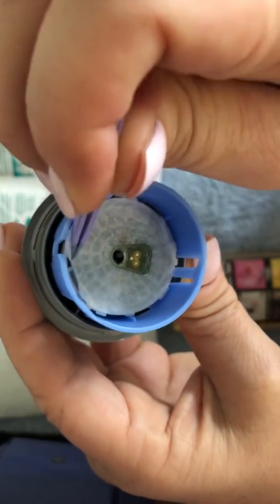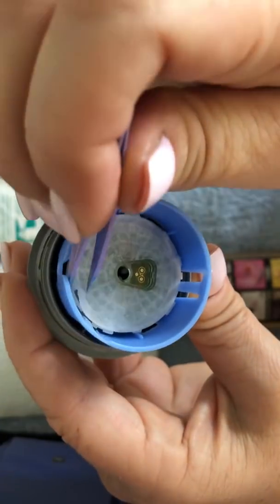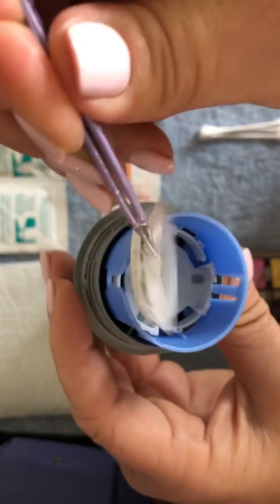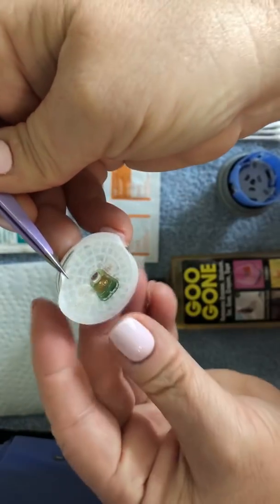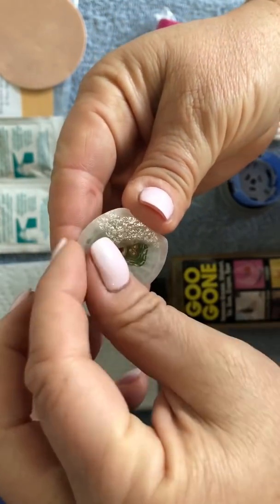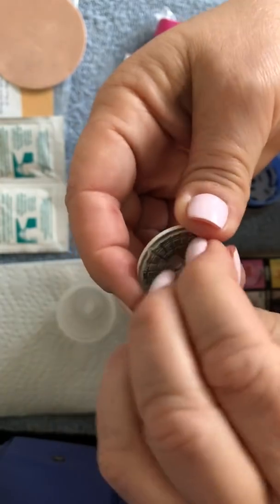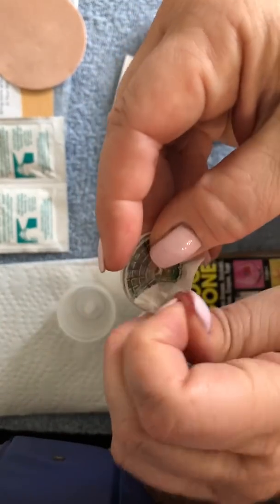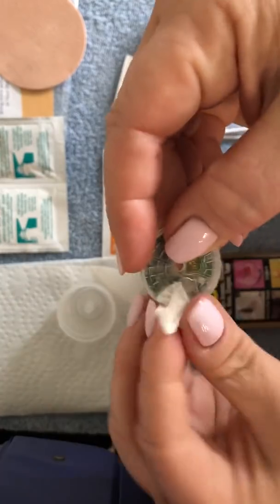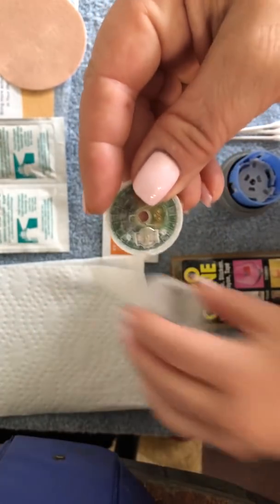So what I'm going to do is take my tweezers here and work the adhesive up and pull the sensor out like that, okay? So if you notice, I have the sensor out and there's the adhesive. What I do is I slowly start to peel it off, and it comes off relatively easy. It's not that hard, okay? And let's get rid of that because it's not good and it kills me.